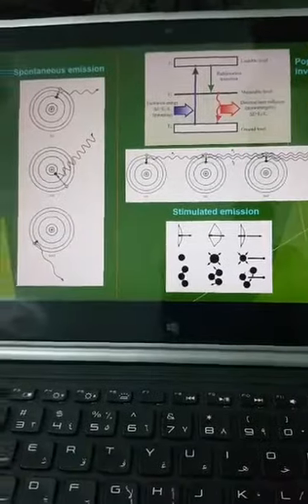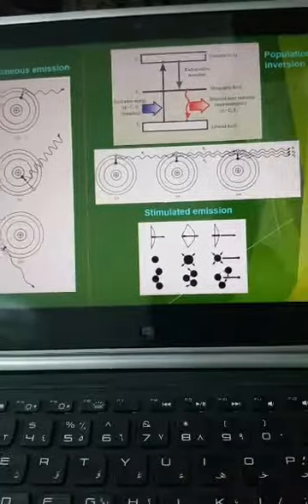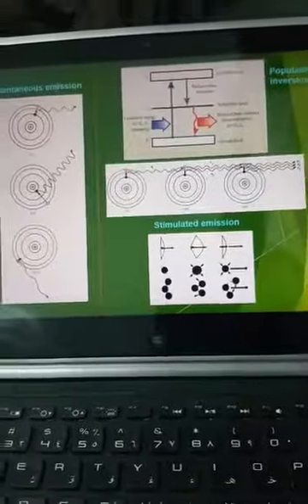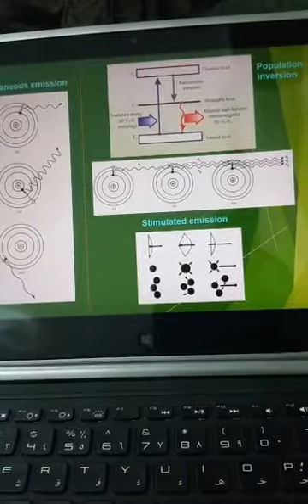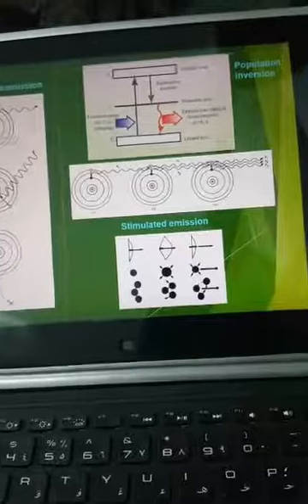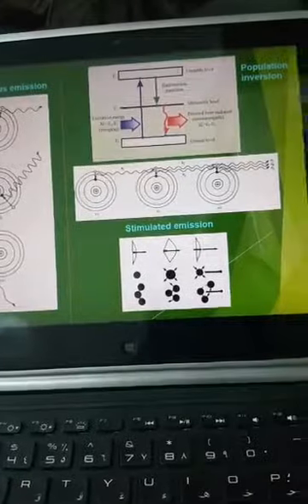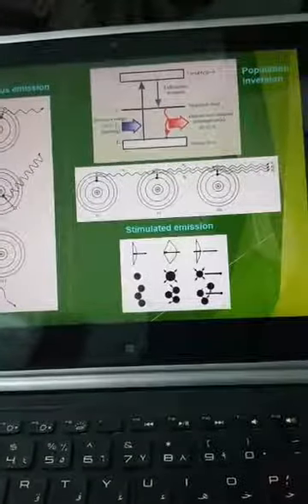The photons, similar concepts to what I studied in physics. When the electron gets energy, it goes up to a higher level, and when it's released, when it comes back to the original level, it emits the photons, and the machine setup helps in producing this wavelength from one direction, and it is concentrated.